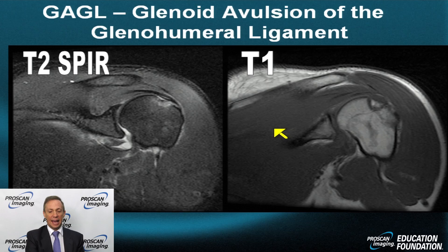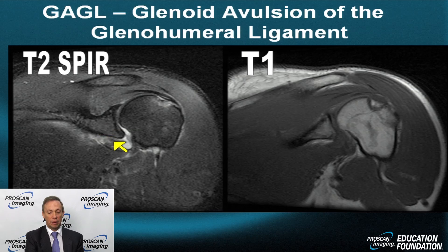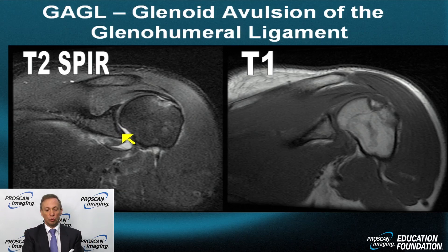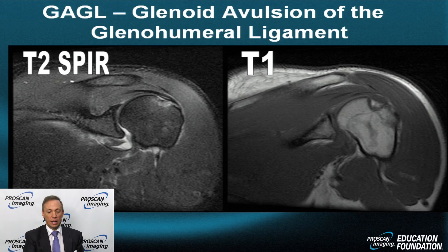Here's another GAGL-like lesion. This one is an avulsion from the glenoid. Unfortunately, the labrum has also come off from its normal position, which should attempt to hug the ball of the humerus. In this case, the inferior labrum is displaced medially under the capsule and periosteum. This qualifies the lesion as something other than a GAGL — it looks more like an ALPSA lesion, an anterior inferior labral ligamentous periosteal sleeve avulsion.